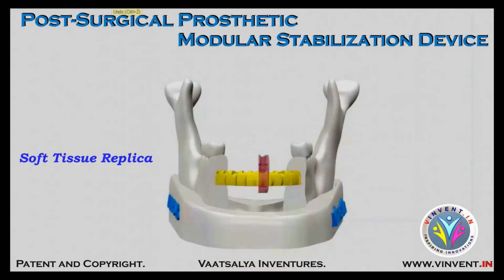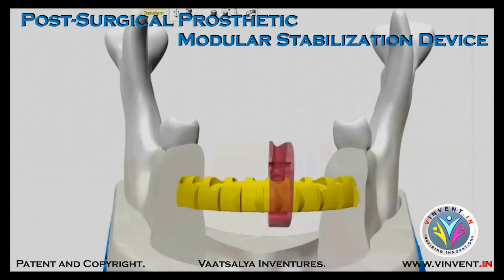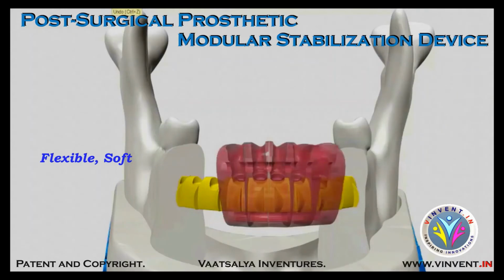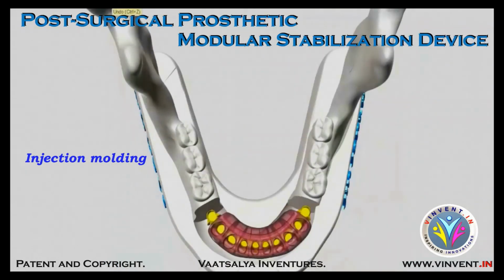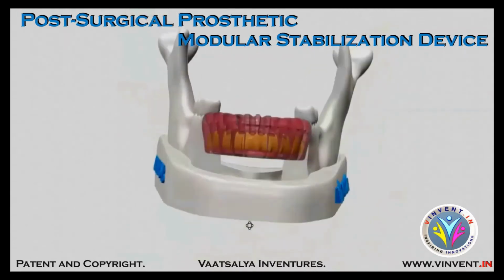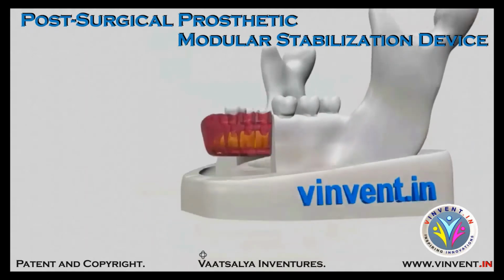Now the second component is a soft tissue replica. It is pink in color. Although translucent in the design, it is solid pink in color. It is a flexible, soft, medical grade silicone type of material made by injection molding of 3D printed molds. This particular component has been made individually for each tooth number. It can be added or removed to the spine based on the number of missing teeth.